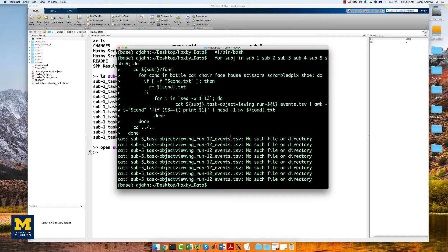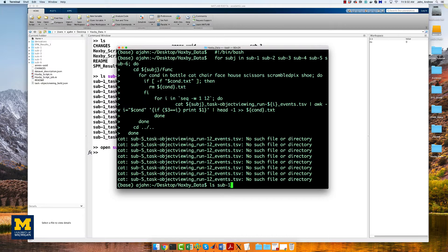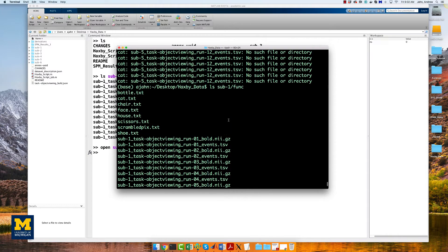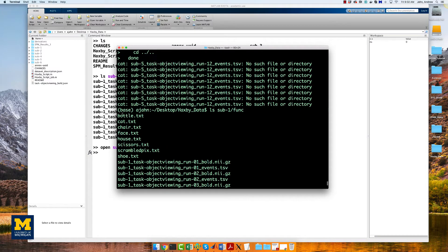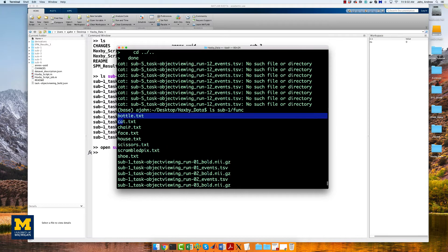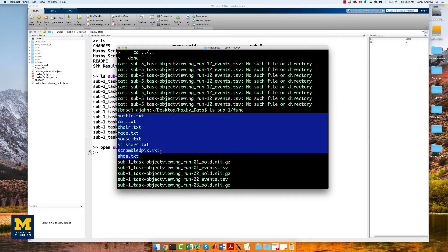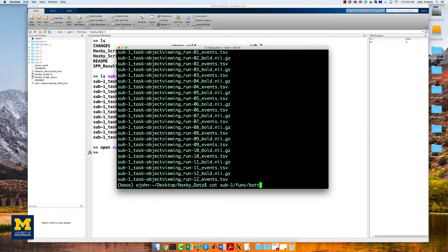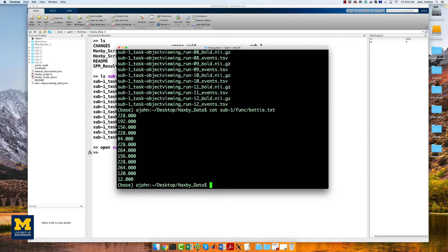This will generate files labeled bottle.txt, cat.txt, and so on, one for each condition, and place it in the appropriate subject's func folder. The contents of sub1's bottle.txt file, for example, will look like this.